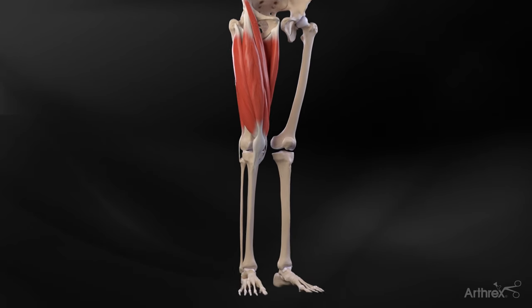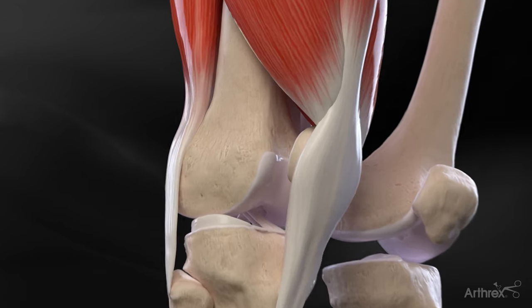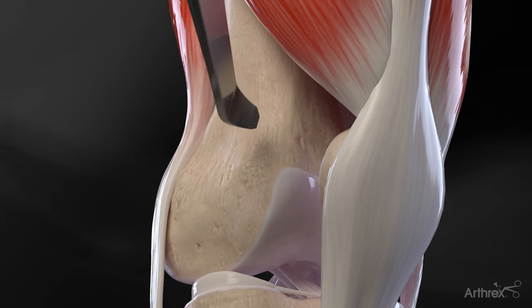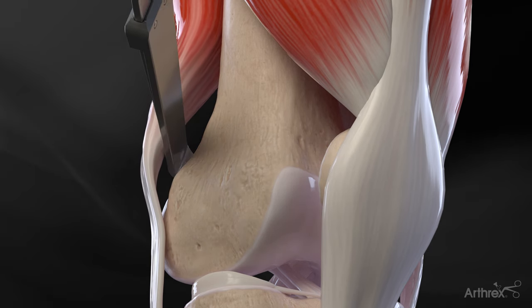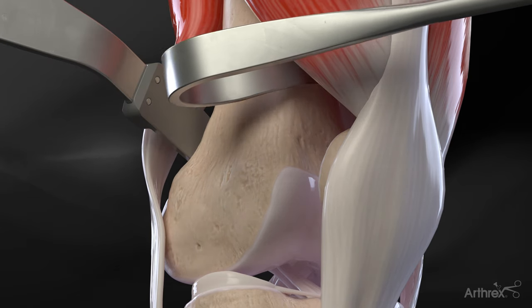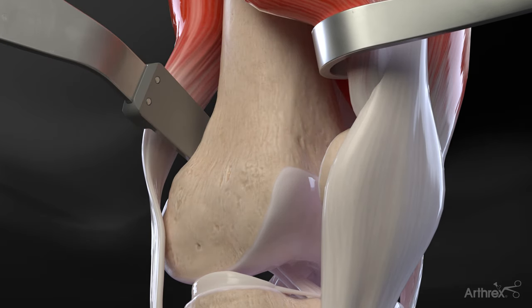With the patient in a supine position, a 4–6 cm incision is made over the distal lateral aspect of the thigh. A retractor is placed posterior to the femur to protect the neurovascular supply. An anterior retractor may also be placed to protect the quadriceps muscle and to create space for the saw to breach the anterior cortex of the femur.